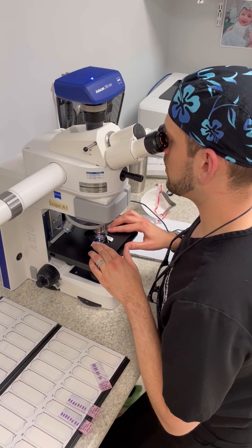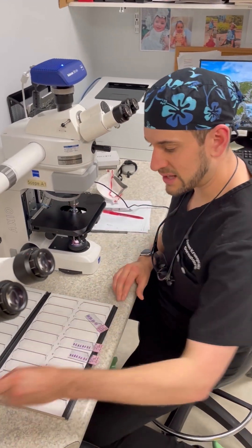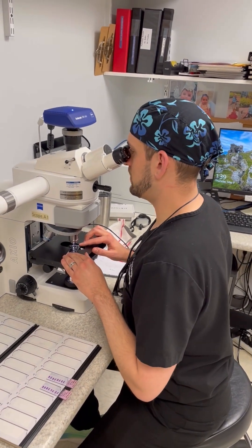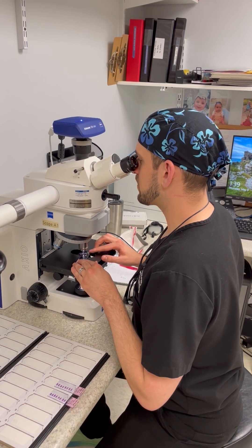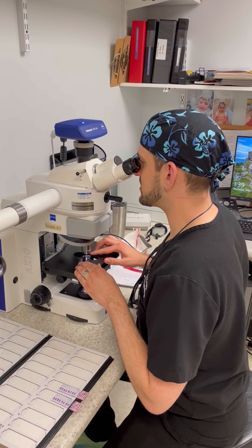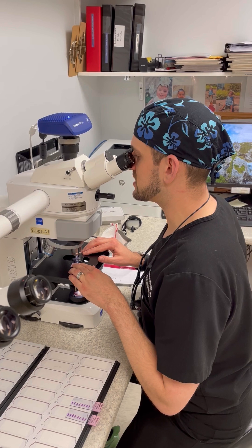Under the scope, looking at all the edges — and in this case, I actually don't see anything left behind, which is great. It's going to be a quicker day for her. She just went one stage and it's already looking like her cancer is clear. But if I was seeing any skin cancer show up at the margin, I would then go to my map and draw exactly where I'm seeing it.